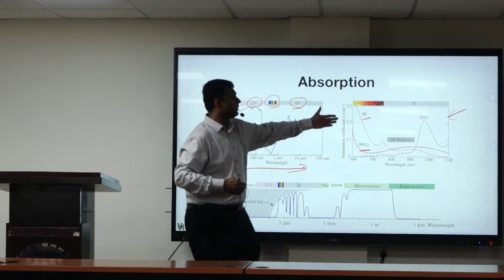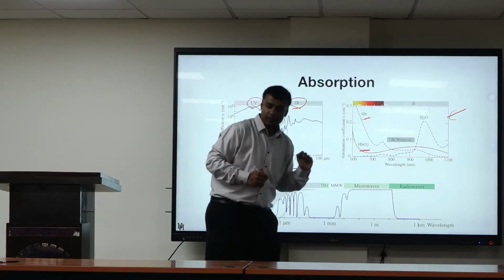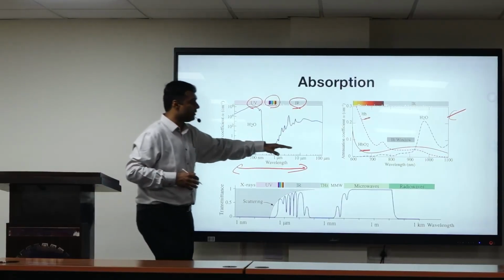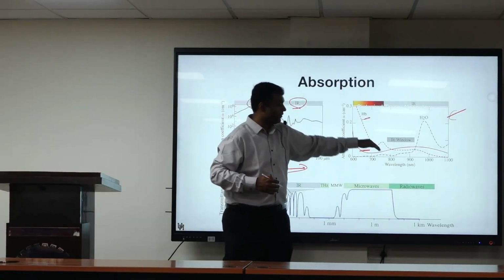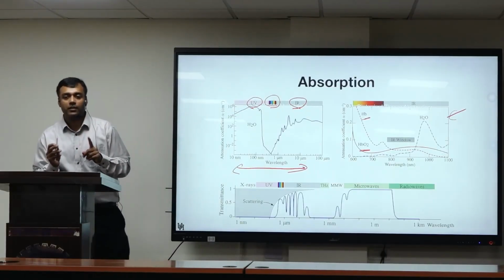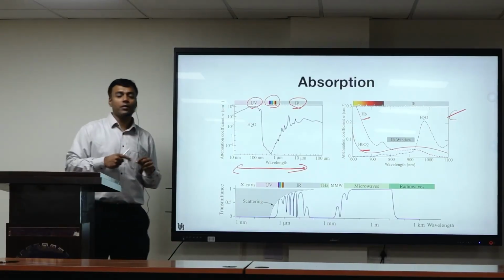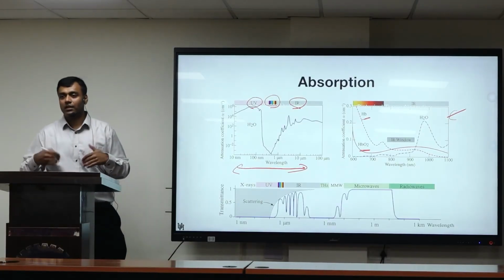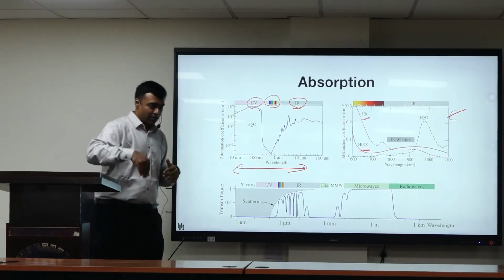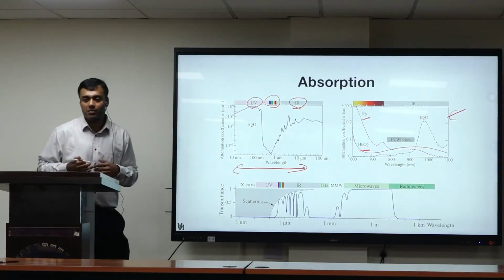It looks at the blood oxygen at different wavelengths. If blood has good enough oxygen, it will have one profile. If it does not have enough oxygen, it will have a different profile. So by making measurements at two different wavelengths of light, that clip you put on can figure out how much oxygen there is. In fact, first of all, it will figure out your heart rate and how much blood is flowing.